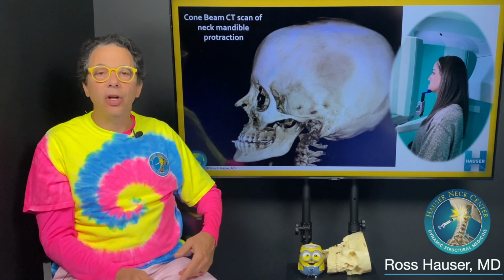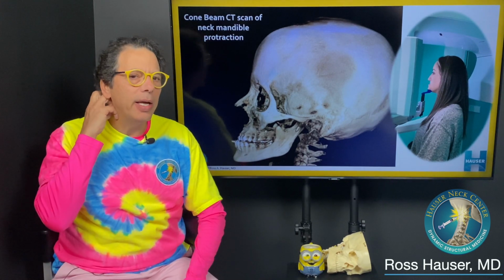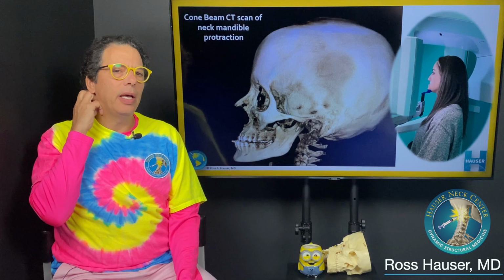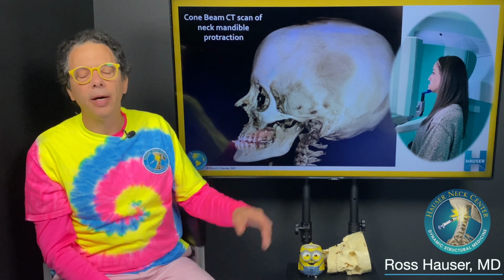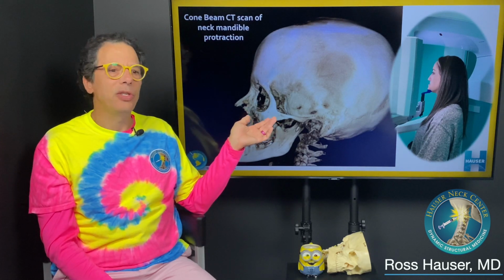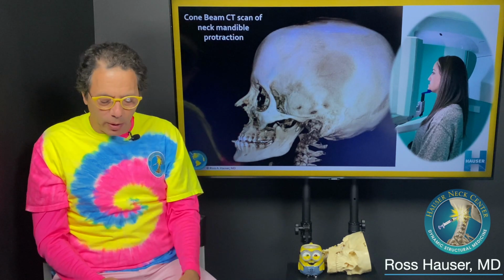Because some of you know, there's a connection between the jaw, the TMJ, and the upper cervical spine. So Izzy just did some different images. You might say, well, didn't she get a lot of radiation exposure? In another video, I'll talk about that.